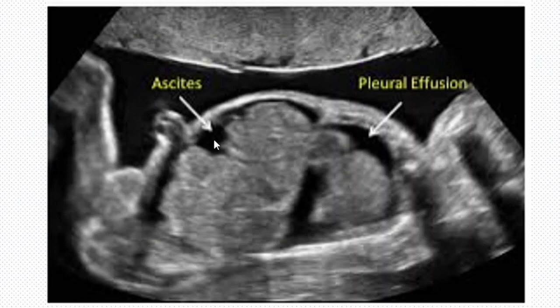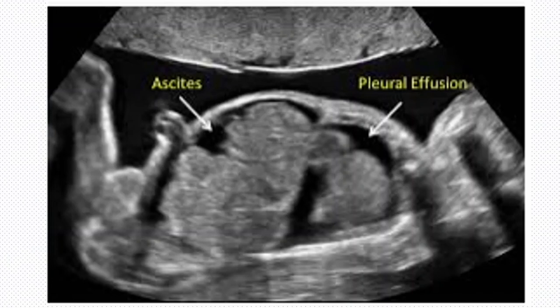This is not the only pocket that has got free fluid. Going up, that's our diaphragm separating the thorax and the abdominal cavity. You can see that in this space there is also anechoic free fluid in the lungs — the fluid found in the thoracic region is called pleural effusion. A combination of free fluid accumulation in more than one pocket is what is referred to as hydrops fetalis, or fetal hydrops.